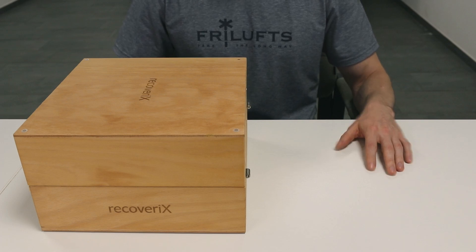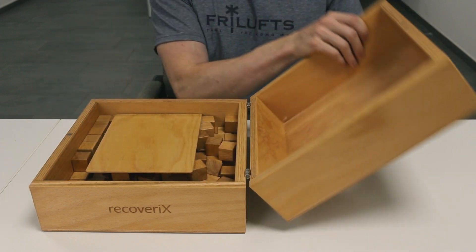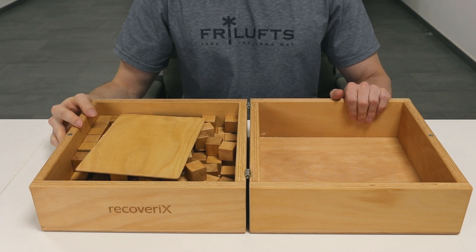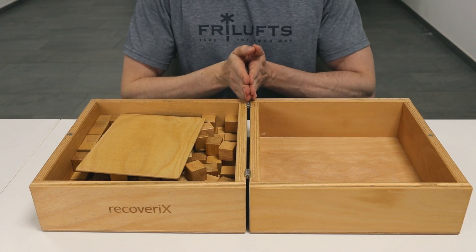The Box and Block Test measures unilateral gross manual dexterity. Patients are seated at a table facing a rectangular box split into two compartments of equal dimension by means of a divider, which should align with the patient's midline. The blocks should be in the compartment ipsilateral to the evaluated side.